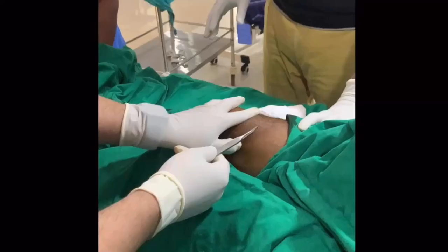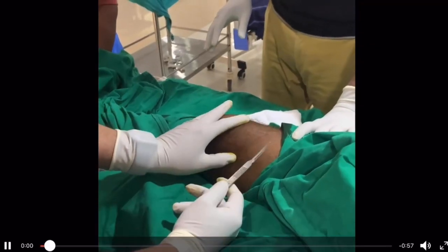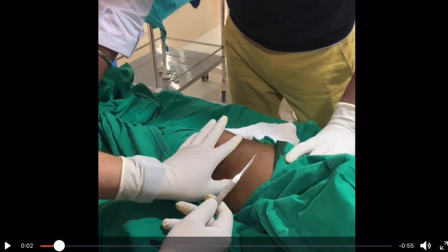First, I have given local anesthetic on both the medial and lateral sides — the proposed sites where the pin is going to go in and come out. The starting point is just proximal to the superior pole of the patella, right here.